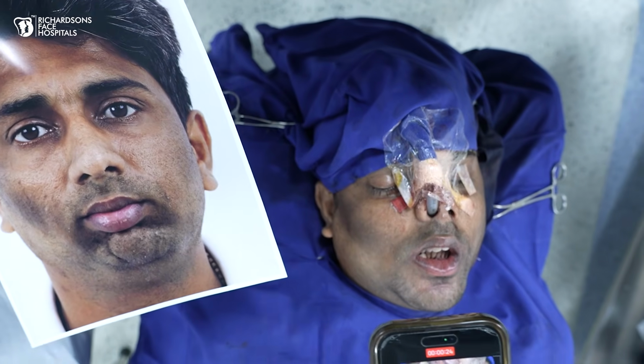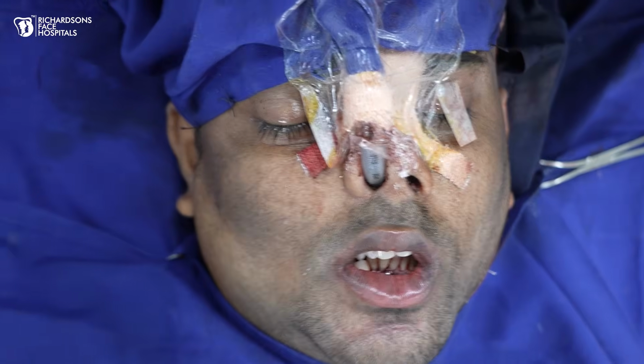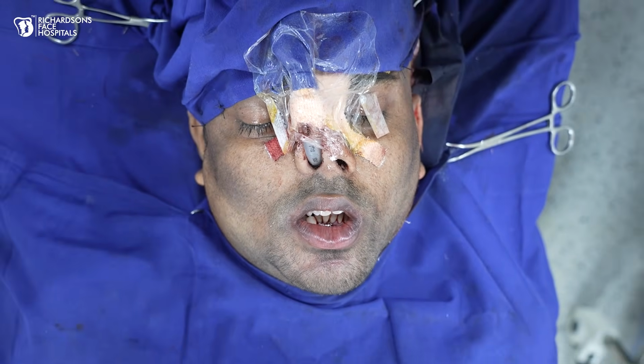Remember, this is not just a cosmetic case because he couldn't open his mouth, so we've done work on the left side. I want to show that because we have yet to suture up there.